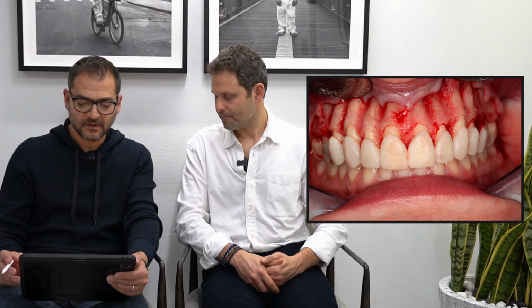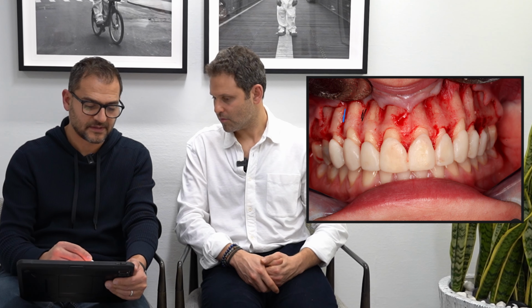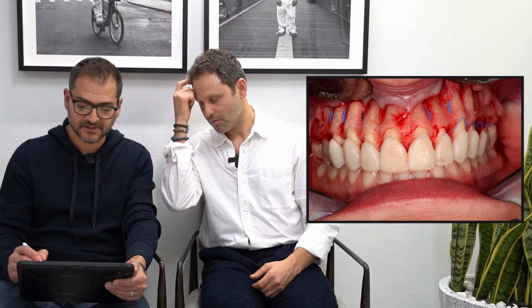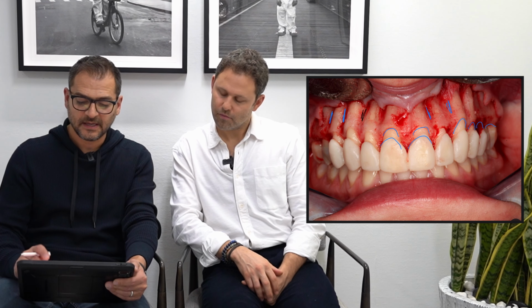And this is the final work, where the final amount of bone reduction, and you can hopefully appreciate that we were able to create these root prominences by trimming into these areas. We also obviously addressed the heights of the bone levels relative to the proposed veneer heights. And in the end, when you suture things back in place, you have a much more harmonious result.